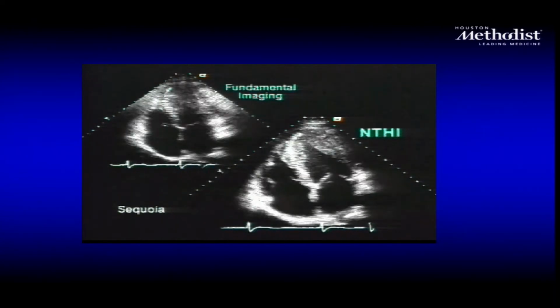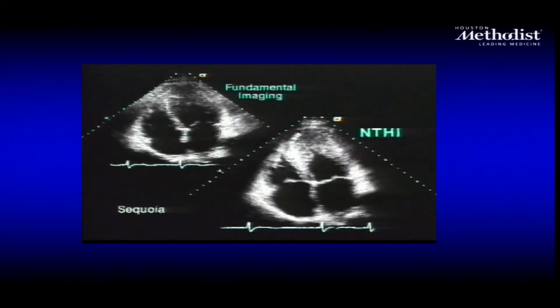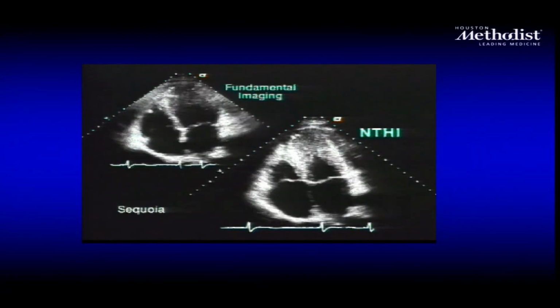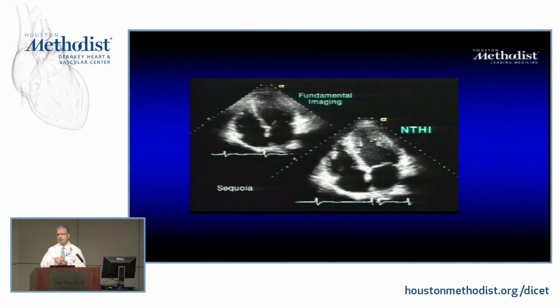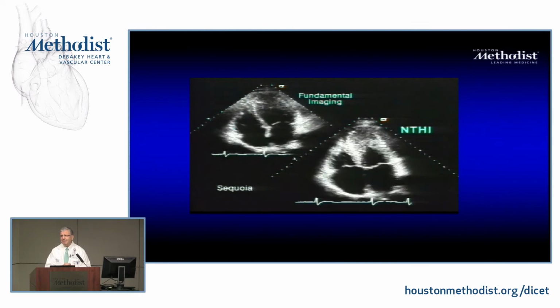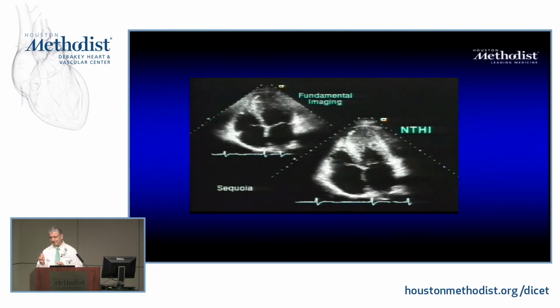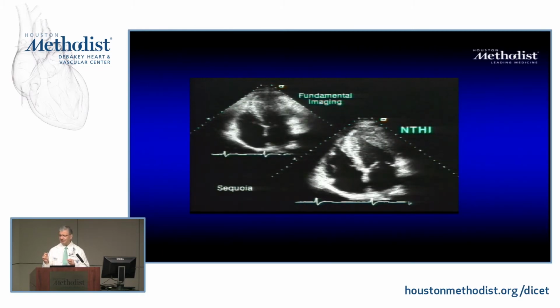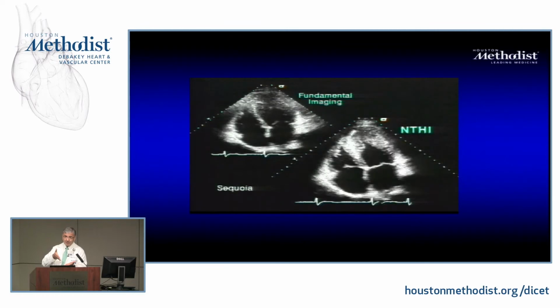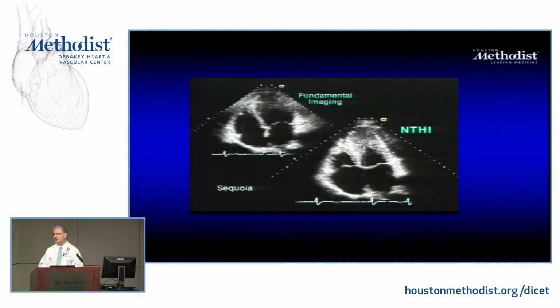So I want you to take a look at it, right? Now the interesting thing you need to know, I know we don't emphasize as much, but when I tell you, all right, I'm imaging at 3.5 second harmonic, and it usually has an H or something like this, my fundamental frequency is half of that. And therefore, my resolution is altered down a bit. That's why things may look a little thicker. So you have the pro and con of using a fundamental that is low frequency, but the advantage of harmonic taking away the clutter and making the image much nicer.